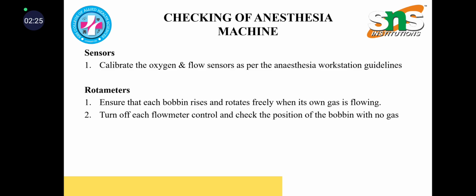Rotameter. Ensure that each bobbin rises and rotates freely when its own gas is flowing. Turn off each flow meter control and check the position of the bobbin with no gas.